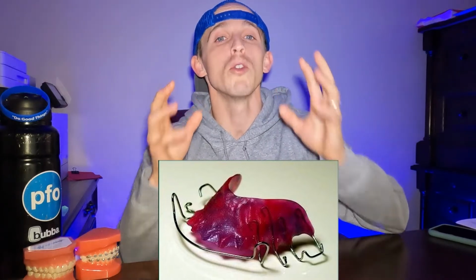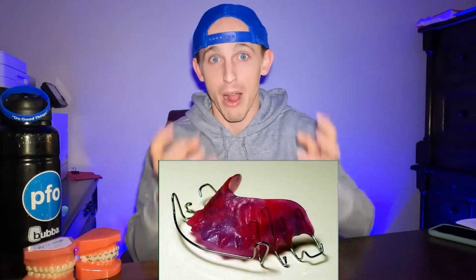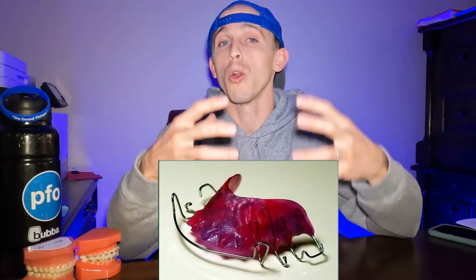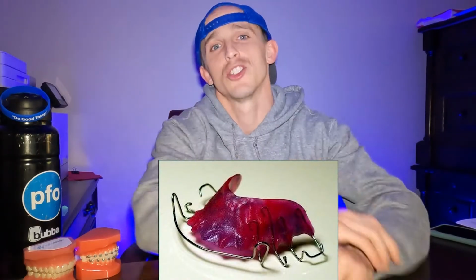Okay, the traditional Hawley. This is another removable retainer. That means you can take it in and out of your mouth. This type of retainer combines acrylic with metal wires that reach over your teeth or around your teeth to help hold the retainer in place and keep your teeth straight. Okay, these retainers, along with the clear retainers, can last for years. You might notice some acrylic that breaks or some of the wire pieces that go over the teeth. Those might break too, but just because they break doesn't necessarily mean that you need to get a new retainer. Check in with your local provider to see if they think that new retainers would be helpful to keep your teeth straight.